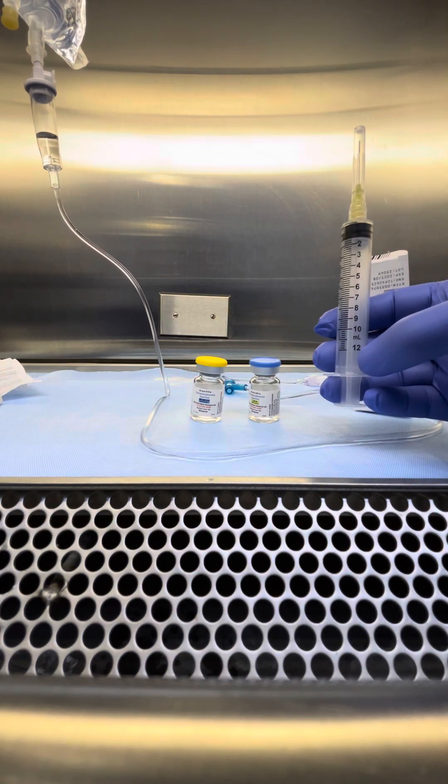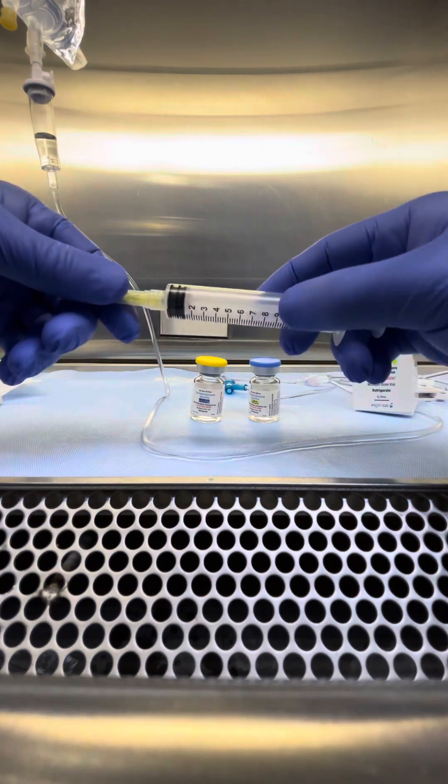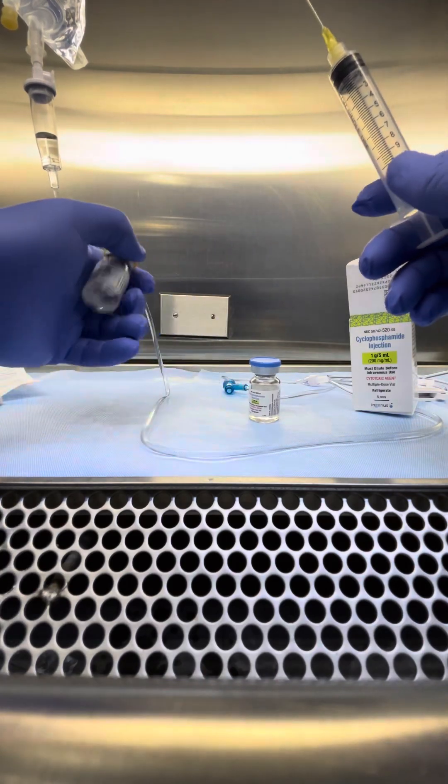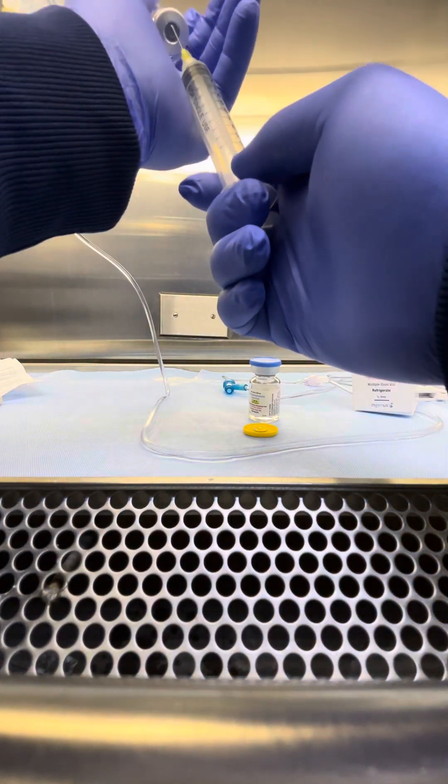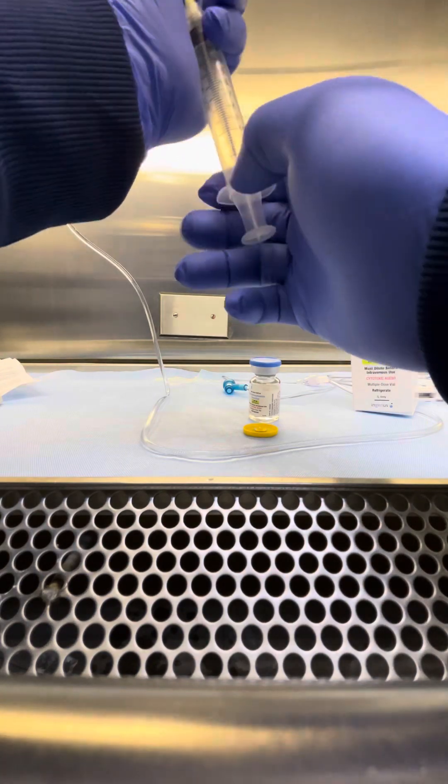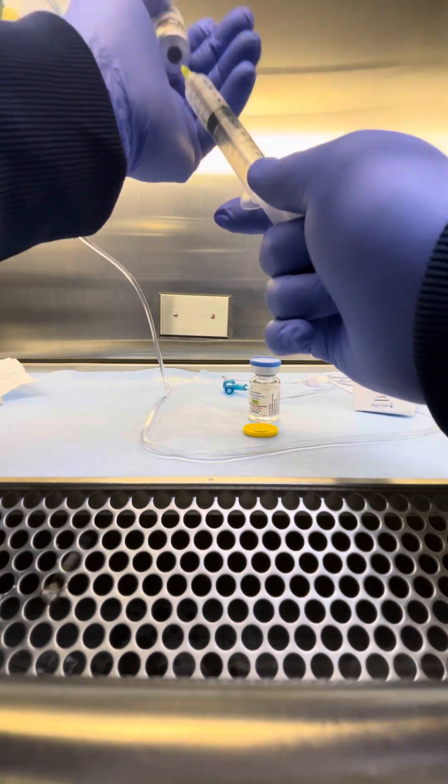I got my 12 ml syringe, and I'm going to pull up 7.2 of this medication. It's the same concentration and the same medication, so we can do it in the same vial.